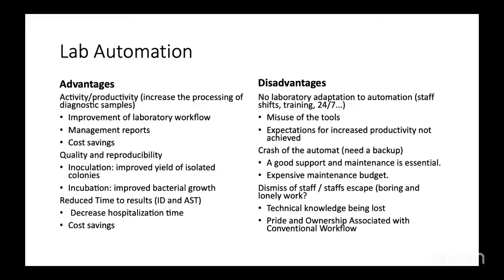Then you need a backup. Today, we have faced this in our lab also. We do most of our work on MALDI, and sometimes when MALDI breaks down, it becomes really difficult for people to go and work on traditional systems. So you need a good support and maintenance system and an expensive maintenance budget. You can't afford for the machine to be down.